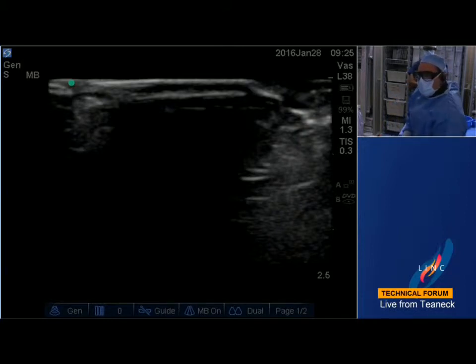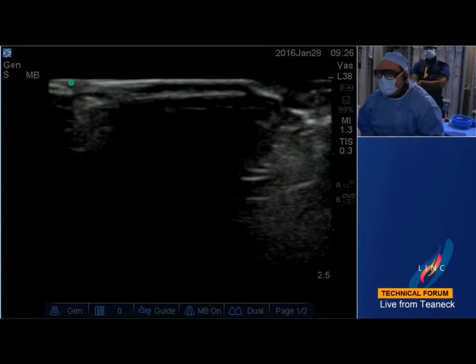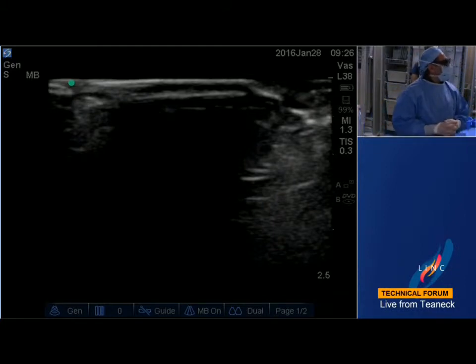So you see there, what do you think about that finding, guys? So we have the ultrasound there, some acute thrombus in there? You're not seeing the... We're not seeing the fluoro right now. All right, let me see if they can get the fluoro. Can you guys get the fluoro picture for them? Hang on, guys. We're hoping that it'll come back up.